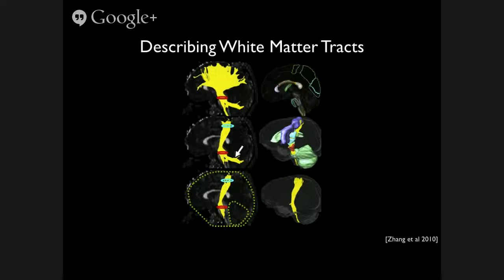And then usually there is a very consistent artifact from diffusion MRI, which goes against using diffusion MRI to prove the existence of tracts, that is extremely common: it comes from the corticospinal tract and goes into the cerebellum. Super common that you'll find this, and extremely well known that this is not a real tract. So then they use a negation, so it cannot go through this.